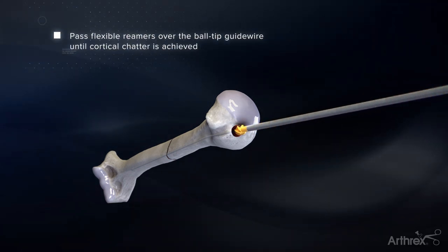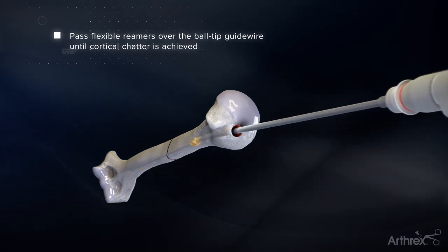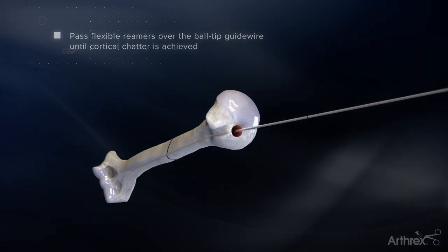Pass flexible reamers over the ball tip guide wire. It is recommended to ream 0.5mm to 1mm above the size of the desired nail diameter.